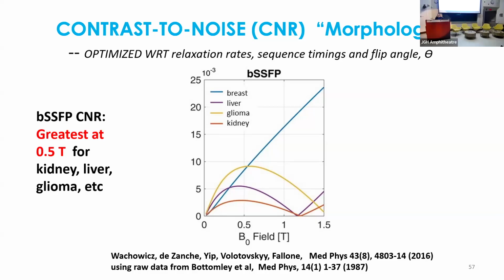I don't know if you know T1, T2s. Nobody knows? Yeah, somebody knows. Okay. At low fields, T1 contrast is very high. I go to 0.5, it gets the highest. When I go up to 1 or 1.5, it goes down to near 0. That's where you need T2 for imaging. So I have all these scanners here that are T2 weighted, but we're not going to use T2 for this. I need fast imaging. So we said, let's go to 0.5. That's why we have 0.5.